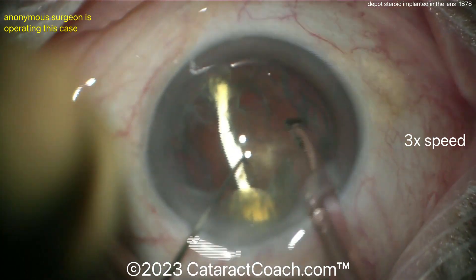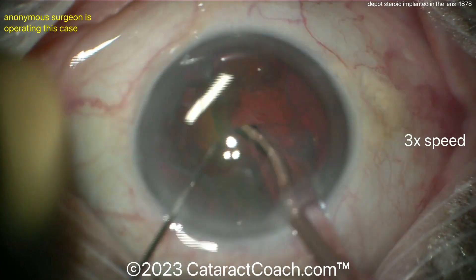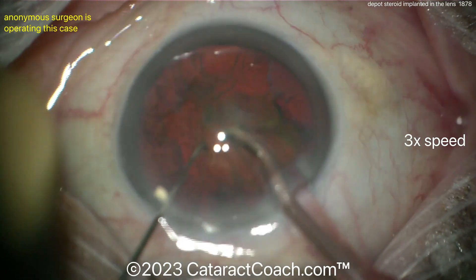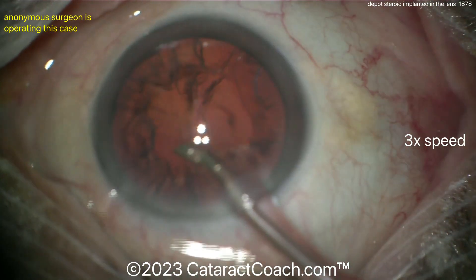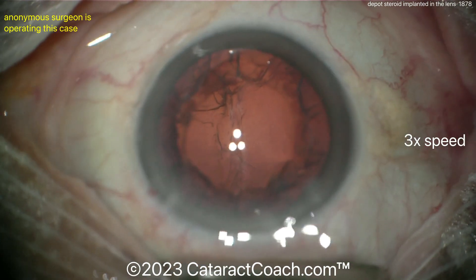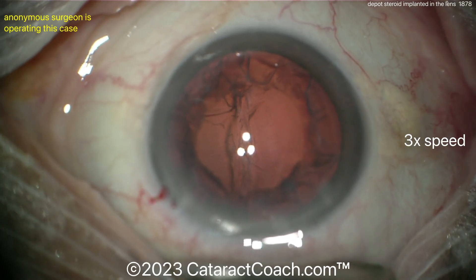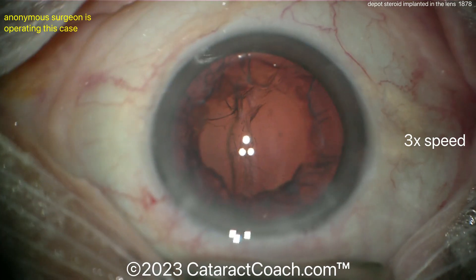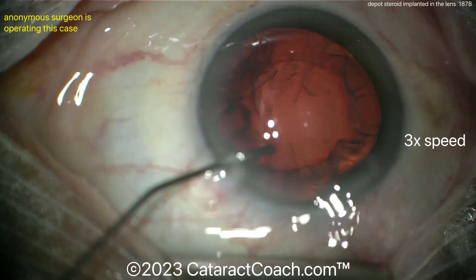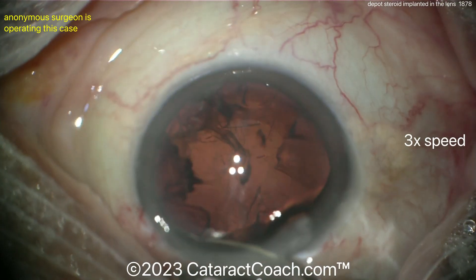Looks like the implant is getting fractured — there's a break in it, and these can be made of various materials. Now it's totally broken in half. Get those pieces out — and yes, you can phaco them; I did not know that. Now, wherever that defect in the implant was, there will be a corresponding defect in the capsule. I like using viscoelastic to prevent the anterior chamber and posterior segment from collapsing — super smart. We've kept this video anonymous. Visco-dissection again with a dispersive agent to get that cortex mobilized in all quadrants.